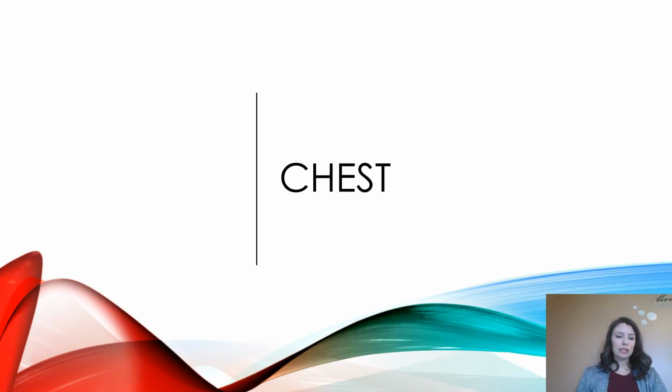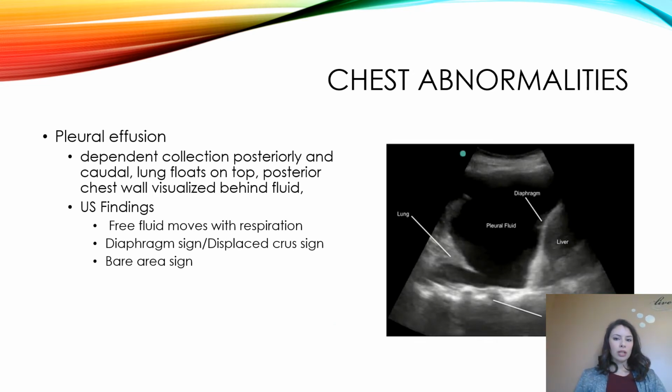Moving on to chest. A pleural effusion. This is a dependent collection posteriorly and caudal.